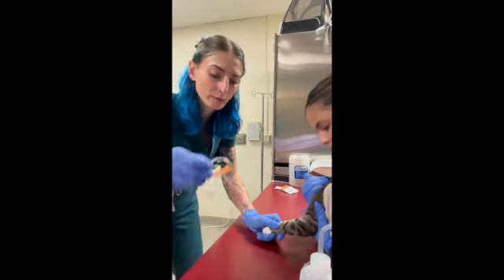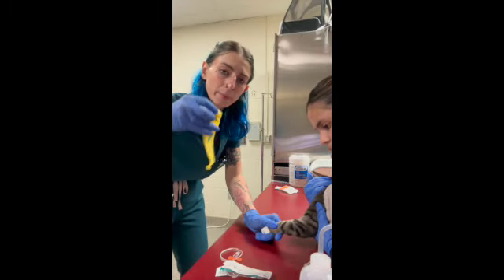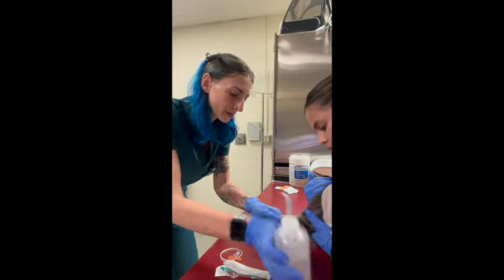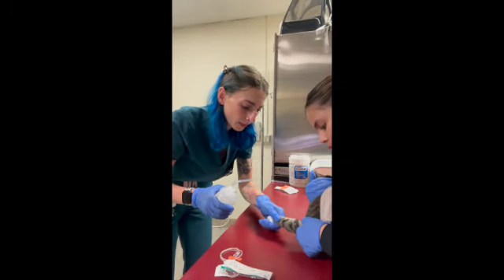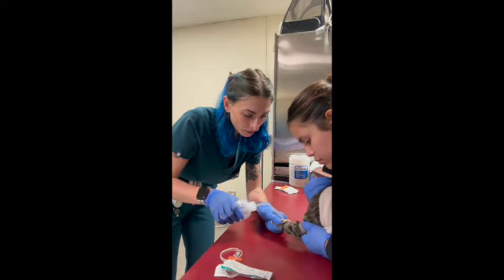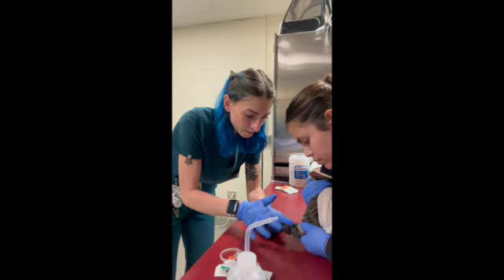So I just have a 24 gauge butterfly catheter, a 1 ml syringe, a band-aid, and then just some isopropyl alcohol. So I have someone restraining already. I'm just going to extend the limb and have her hold and roll off. And I'm going to apply my alcohol here. And then I'm just going to separate the hairs a little bit.